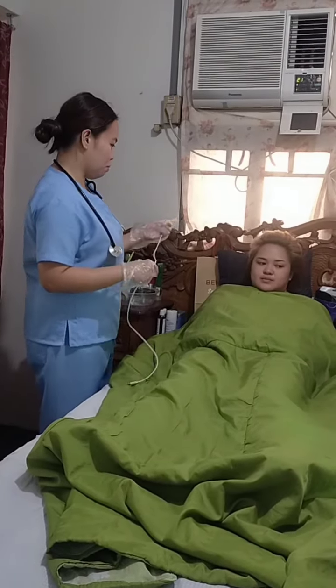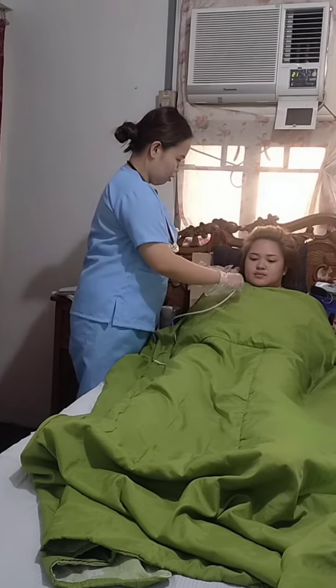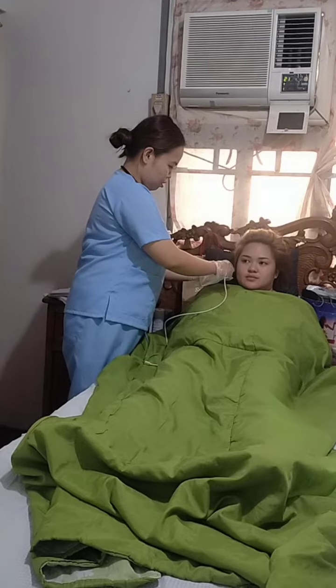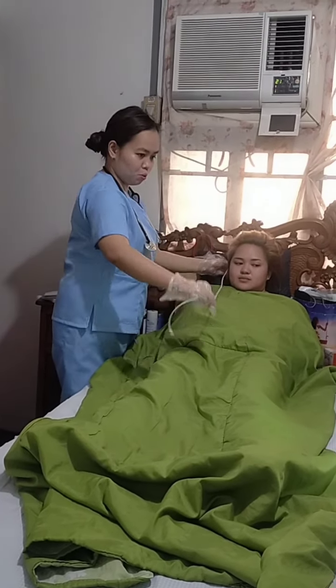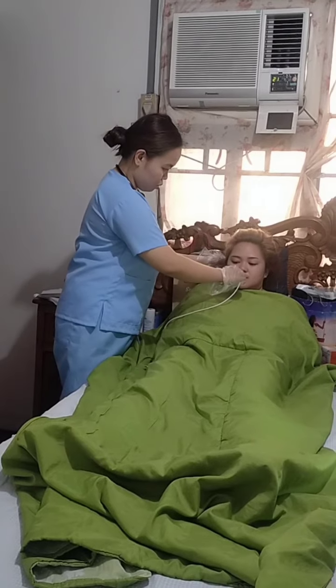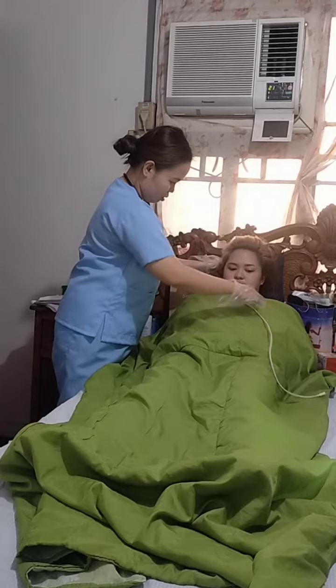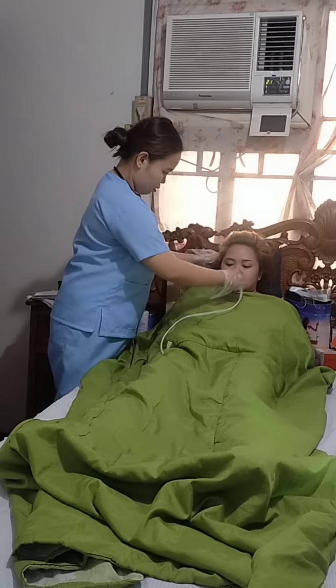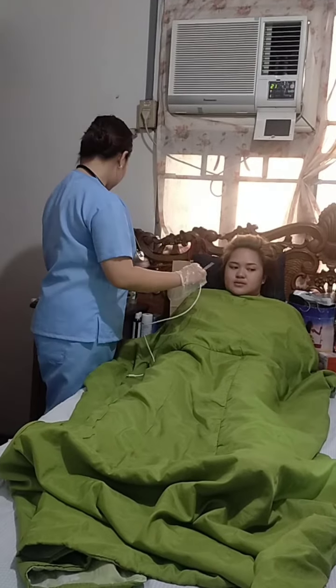Going to measure, ma'am, using the nasogastric tube, from the earlobe to the tip of the nose. And then we're going to mark it using the marking pen.